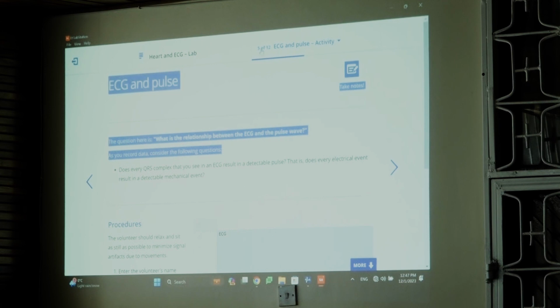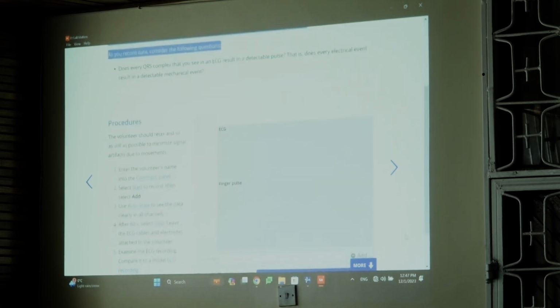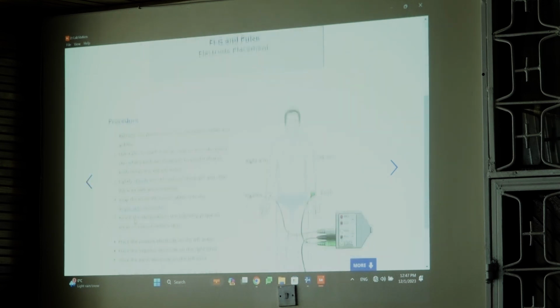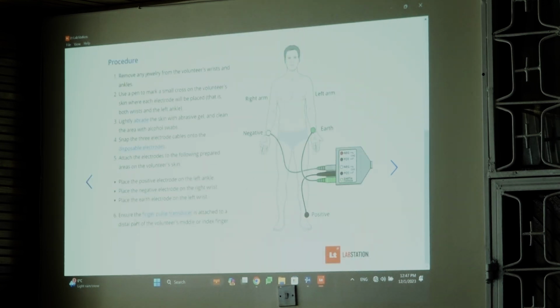Yeah, that's how we set it up. Just go with this one. So, what we need is to record an ideally healthy volunteer. We'll record at the arms and the ankles, so you don't need to remove your dress. So do we have a volunteer who wants to see a recording? Oh, come here.